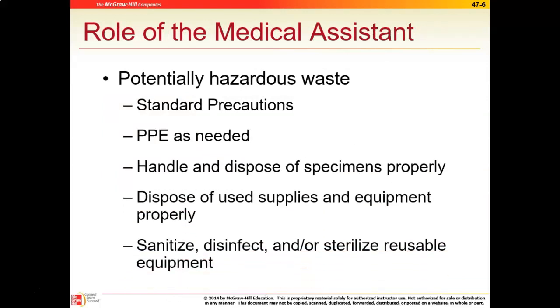Okay, and so it is considered potentially hazardous. Generally, things that are associated with doing the urinalysis will be disposed of in the biohazard. Now urine doesn't necessarily have a lot of bacteria or contaminant with it, but it is still considered potentially hazardous waste. So we always want to utilize standard precautions, washing our hands and putting on our gloves before we touch any urine specimen, even if the urine's not going to touch us. So the appropriate PPE as needed. Sometimes goggles might be necessary depending on the situation. We have to make sure that we handle and dispose of all of the specimens properly. And like I said, we're prototypically going to put the containers in the biohazard.